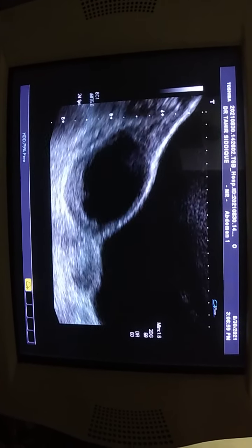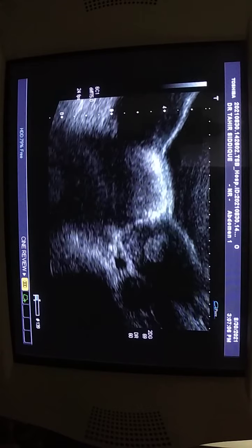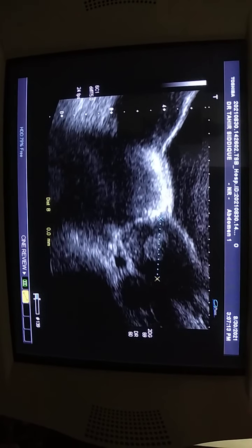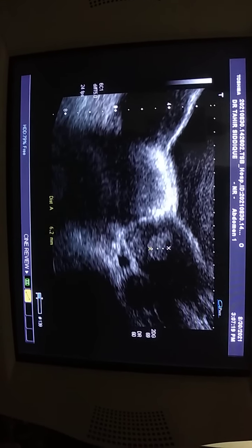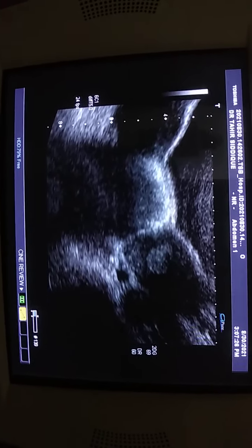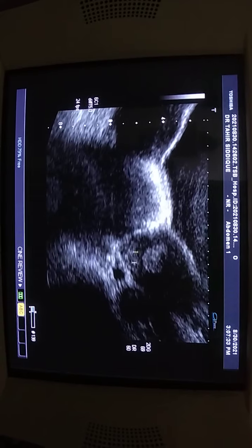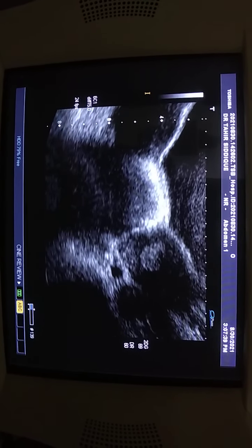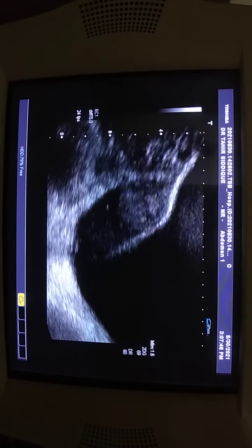Now let's move towards this is the one, and this is the transverse section of the left-sided uterus. This is the transverse section of the left-sided uterus that measures 2.4 centimeters, and this is the endometrial canal. This one, endometrial canal measures 7.6 millimeters on the left side. Now remember, this is the left-sided. This is the left side uterus in transverse section with endometrial canal in the center. Where is the other one? Here, you will see another right side uterus. Here it is.